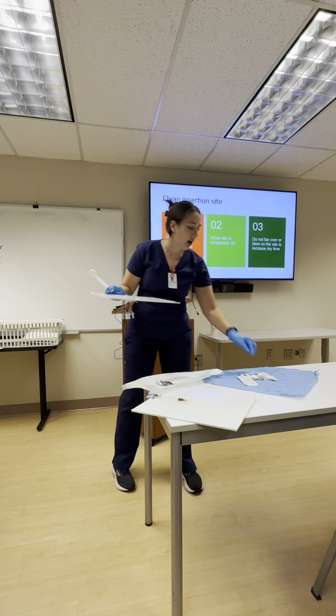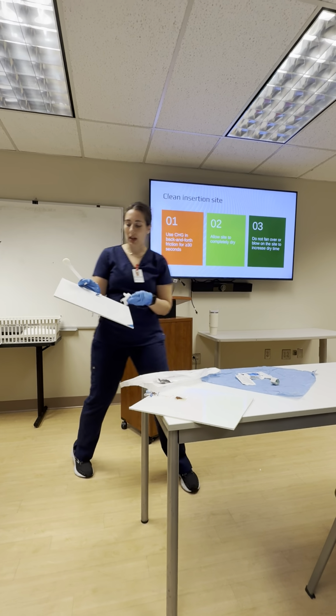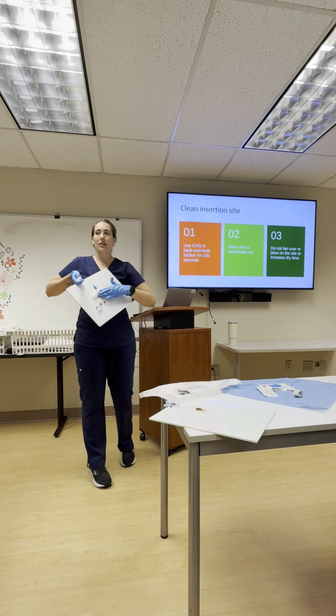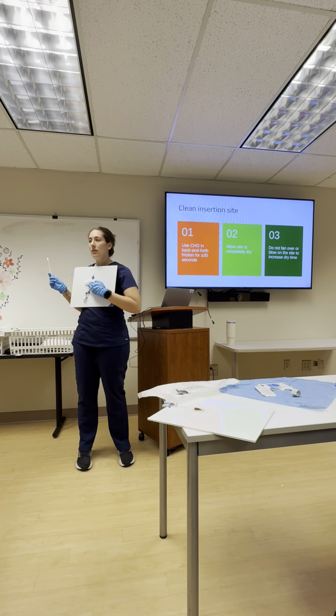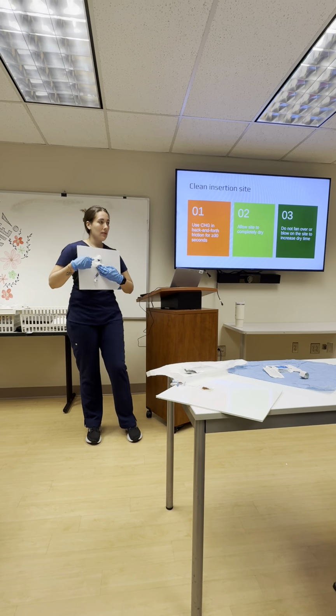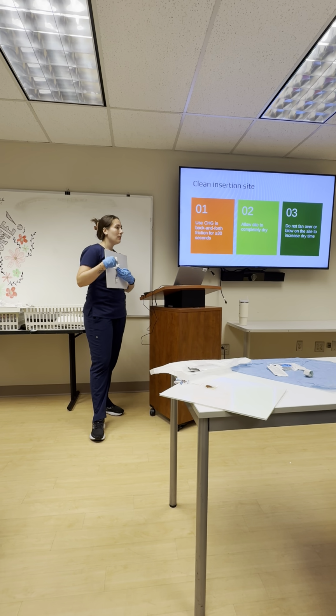We're also going to take a gauze that's in here to stabilize the catheter, like that. So we're sterile with both hands. And then you want to scrub the site back and forth for 30 seconds.